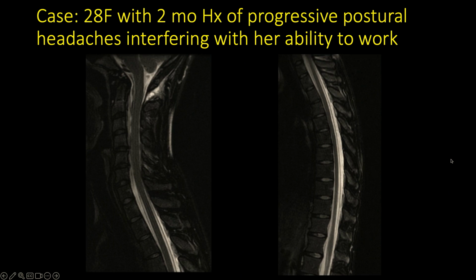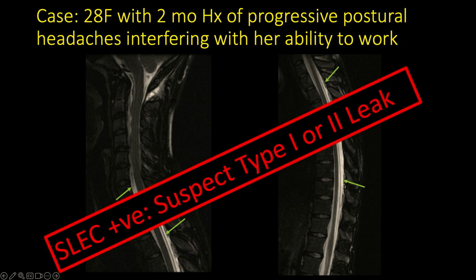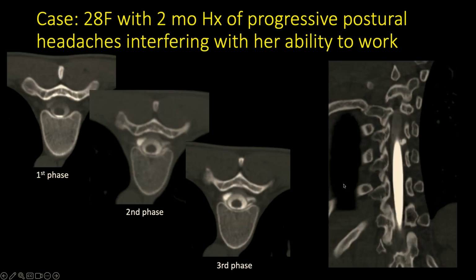Here's the patient's total spine MR. These are T2 fat saturated images. We see a big SLEC dorsally along the whole thoracic spinal canal. So we're SLEC positive. Again, we're thinking type 1 or type 2, fast CSF leak. Patient's going on to dynamic CT myelography.